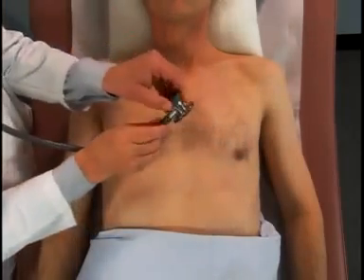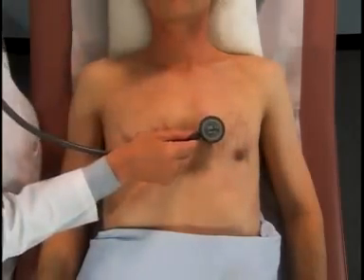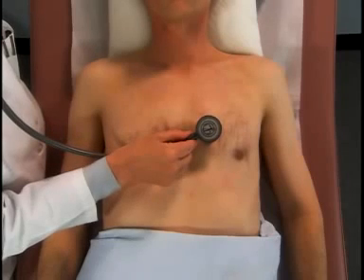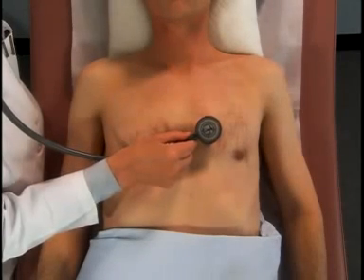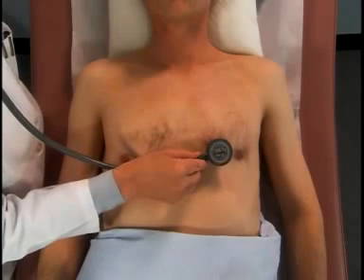Now, switch to the bell of the stethoscope. Listen next along the lower left sternal border in the left fourth and fifth interspaces. Then listen at the apex.